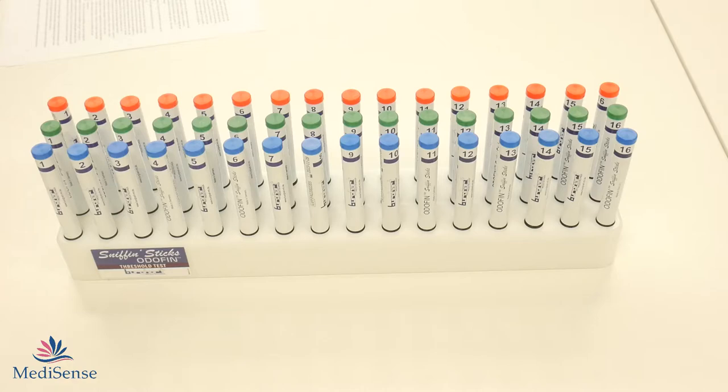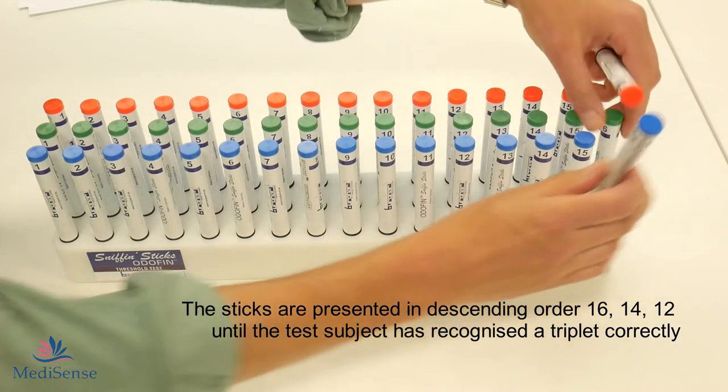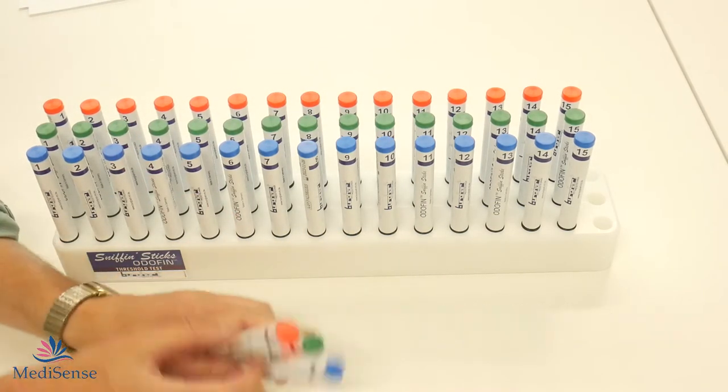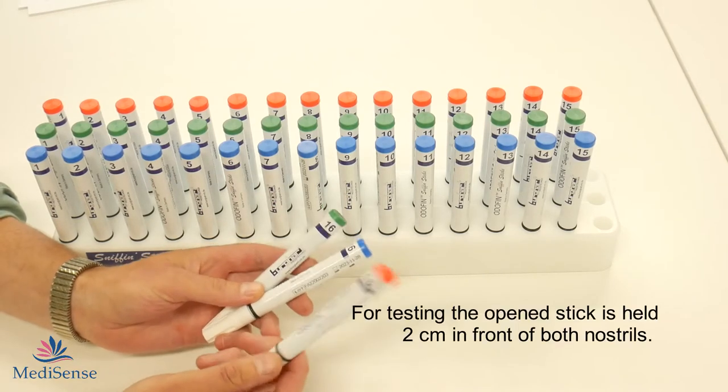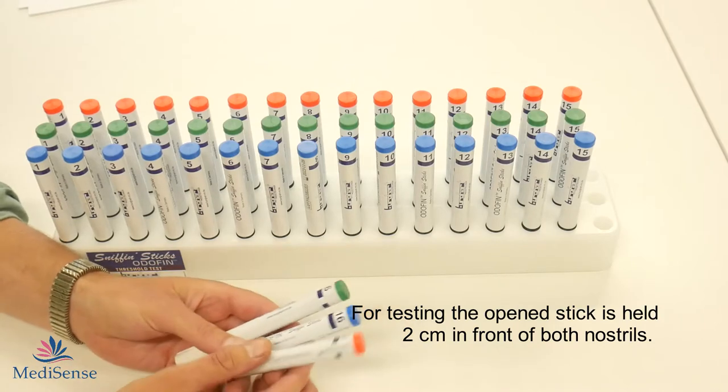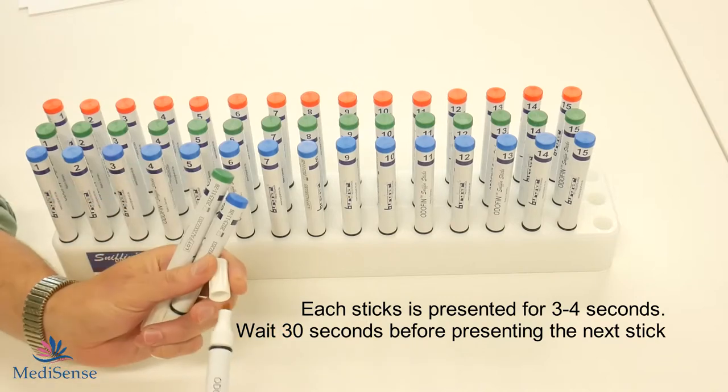Okay, now the test procedure. When you start the test you offer the 16 pens with the lowest concentration. The red one is the target pen which has to be guessed by the test person. You offer each pen, pull off the cap and offer it to the test person.